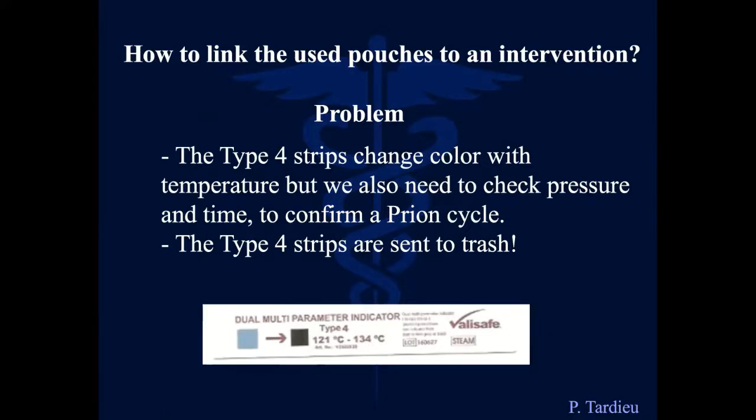This is showing what? That you've been able to reach this temperature. Remember what I said to you. There are 4 things to show that it's sterile: the temperature, the time, the pressure, and the dryness. In this case, this is only showing you that you've been increasing the temperature up to 134 degrees. It is not showing that it is sterile, but it is an indication.